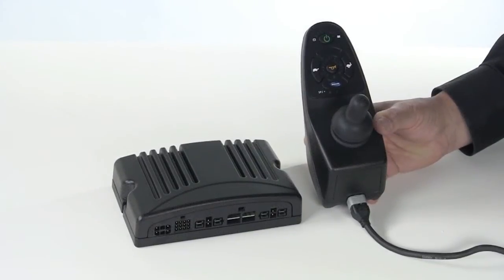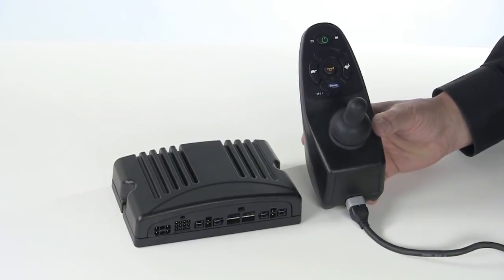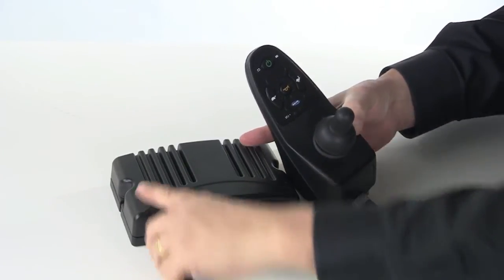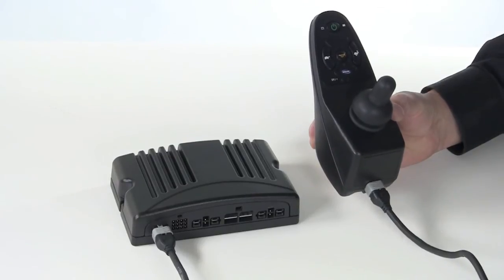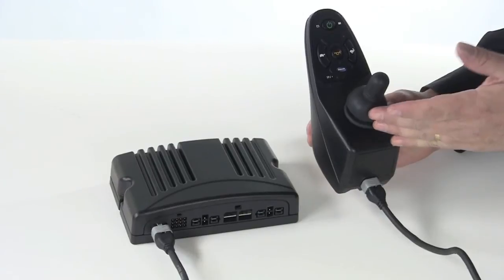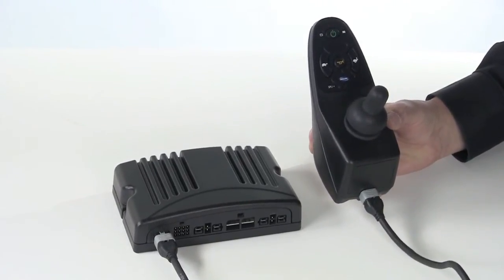All power wheelchair controllers fall into one of two categories: non-expandable or expandable. With a non-expandable controller, only a standard proportional joystick may be used as the input device. It may have the ability to control up to two powered seating actuators through the driver control, but this would require an additional component. No other driver controls, proportional or digital, may be added.